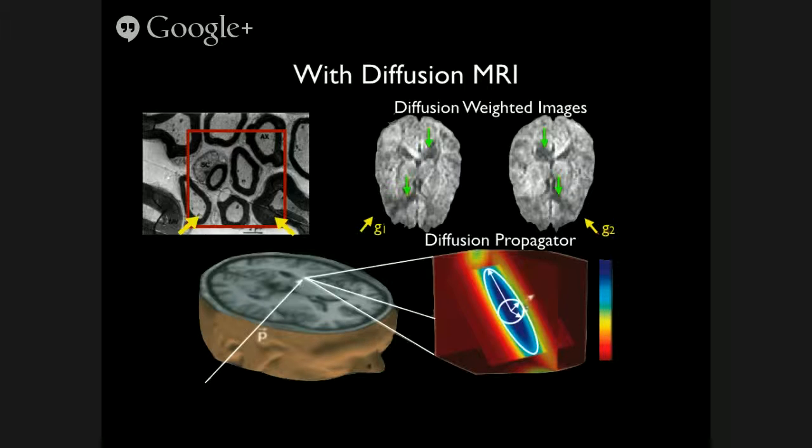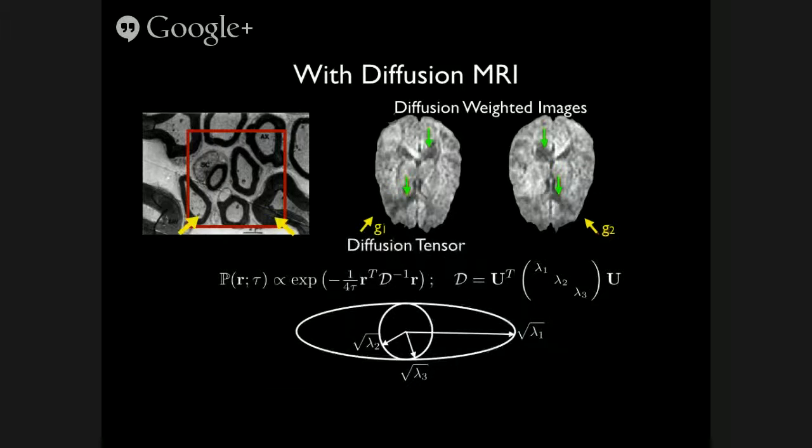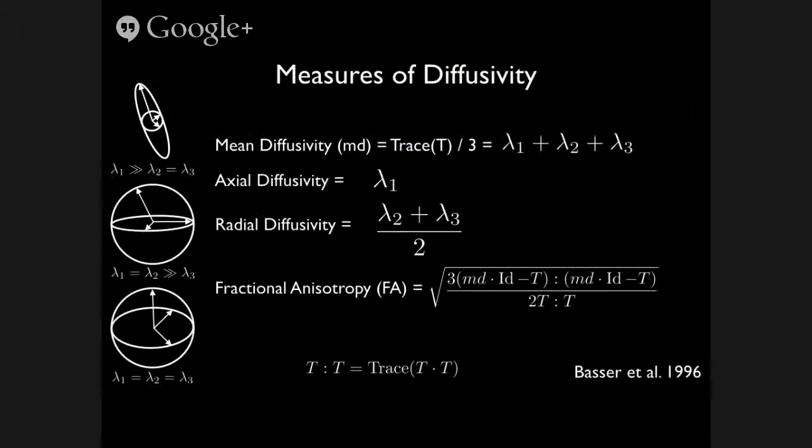Okay. We can impose a model, and then what we have there is what's called diffusion tensor MRI, which is assuming that that propagator is Gaussian. Well, you might know very well that this does not suffice in areas where, for instance, the tracts are crossing. Mostly because the propagator shape will be this, because this is the configuration, and this is what you get from diffusion. So there's many techniques to actually disentangle that from high angular diffusion.